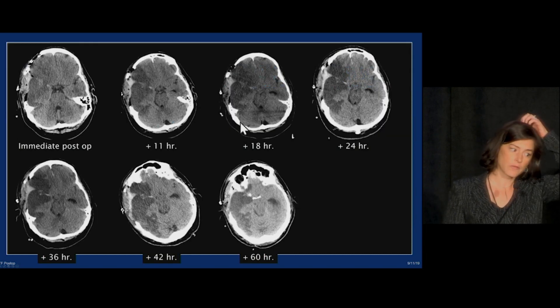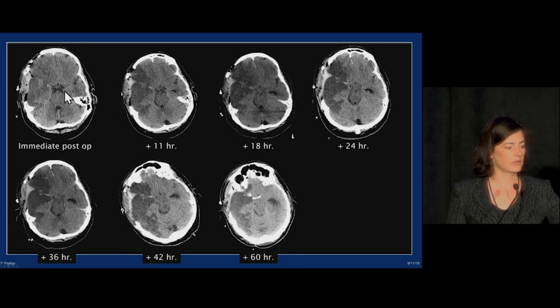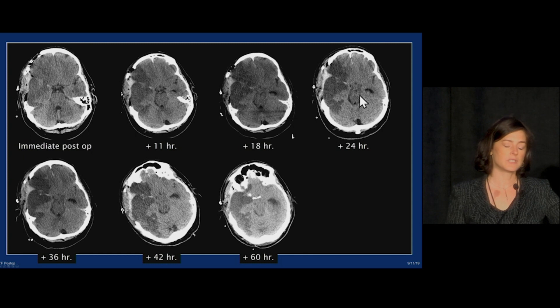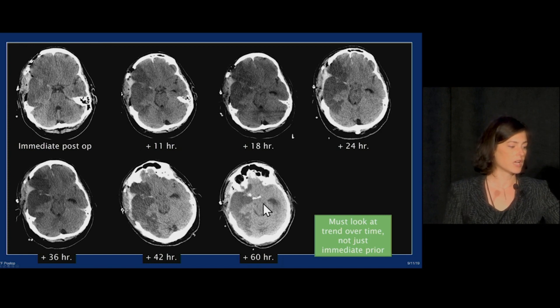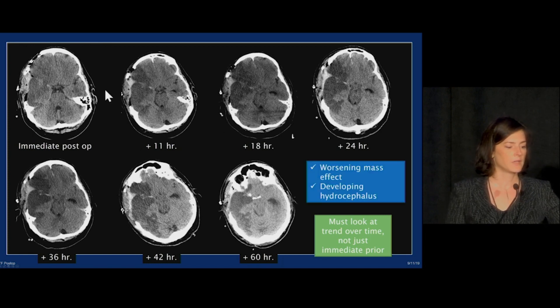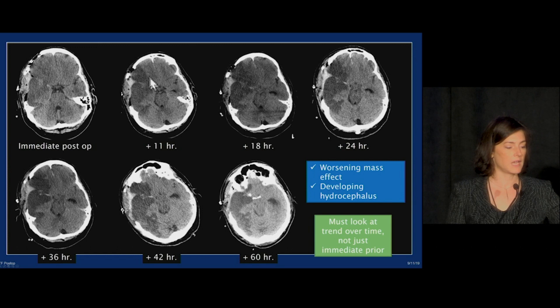As we look at this patient over time through multiple head CTs, notice the temporal horn of the left lateral ventricle on the contralateral side — it increased in size a little bit, then increased again, then again. If we made the mistake of only comparing to the most recent prior, we might not notice this progressive, inexorable, developing hydrocephalus. We must look at the trend over time and go back to an early study. Developing hydrocephalus, since we're mostly focusing on the area of infarct, is something we don't want to miss.